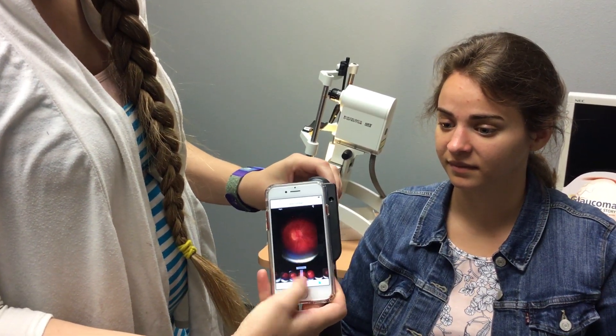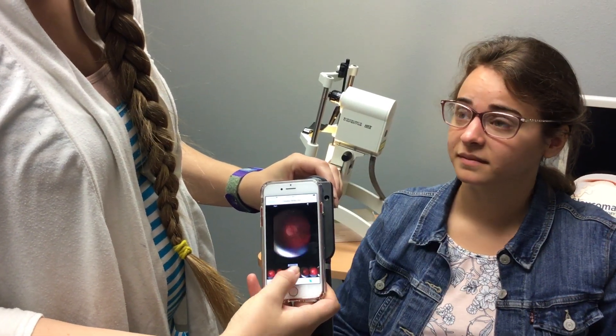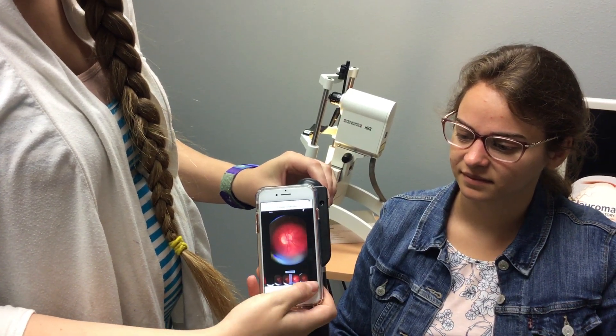Here are the pictures — you just press the add button. You can also swipe the screen and get some pictures that way too.